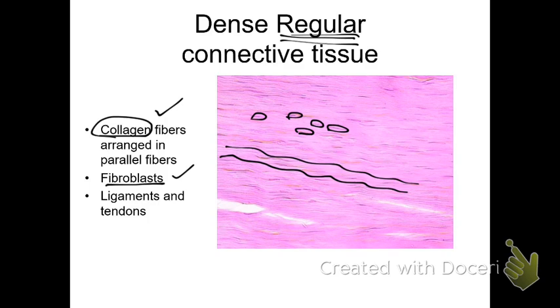Going back, I forgot to mention one of the characteristics of cartilage. Cartilage is avascular. So when you look at hyaline cartilage or fibrocartilage or elastic cartilage, it's very translucent. It's very clear. There is no blood flow. And this is why if one has damage to their intervertebral discs or to their meniscus in their knee, it doesn't repair itself. Once that cartilage is worn down in an arthritic change, it does not restore itself. It's also the reason why if a person has their ear or their nose pierced, there's relatively low blood flow, because the cartilage of the ear has very little blood flow going through it.